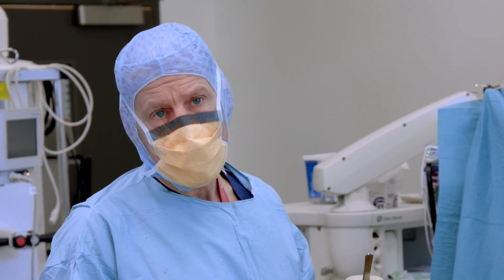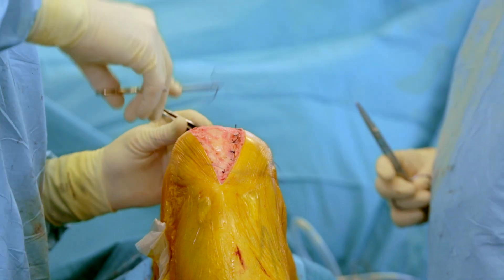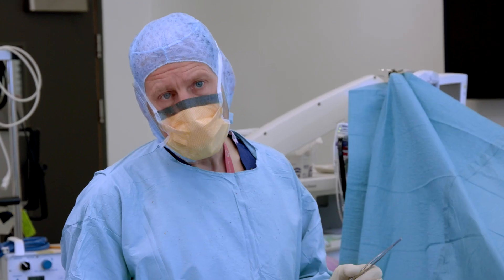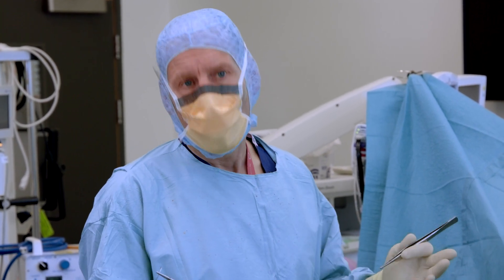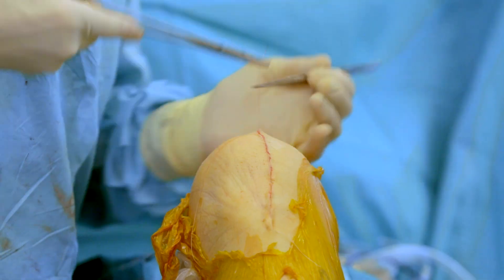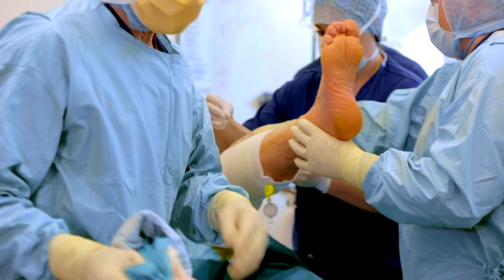My experience of using this robot is that it does precisely that — it enables surgeons to do what they need for each particular patient. Doing regular knee replacements very reliably and well will be the first step, but I also think it has the ability to help with very complicated and difficult cases, or patients whose alignment is not normal — outliers — and it will help us to get them right. I'm very lucky to be able to have one. I think this is the future. Personalisation of surgery is where we need to be going, and I'm absolutely certain we will see a huge take-up of this technology, because for patients to have a personalised knee replacement and great function at the end — that's what we're aiming for.